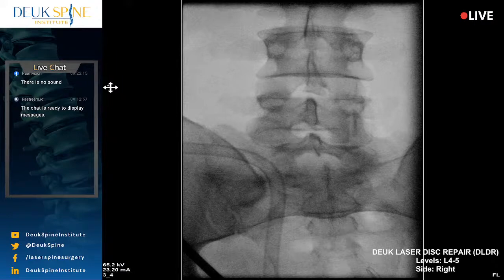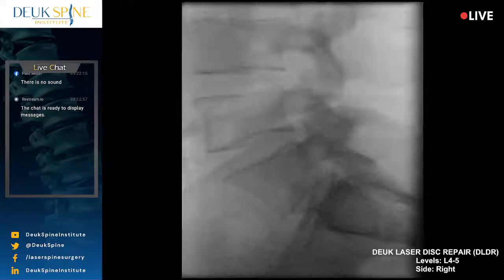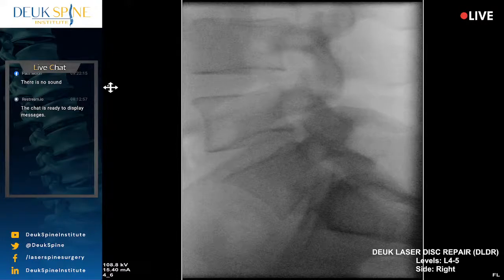We need to get the blood pressure down a little bit, so I'm just going to wait a minute until you do that. There's a window where blood pressure is acceptable for surgery, and for this type of surgery the surgeon likes systolic blood pressure around 90 to 110 maximum, so about 20 points between 90 and 110.